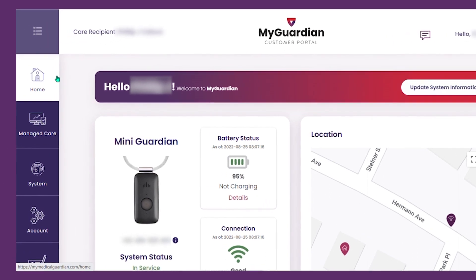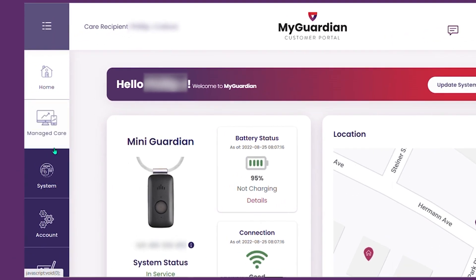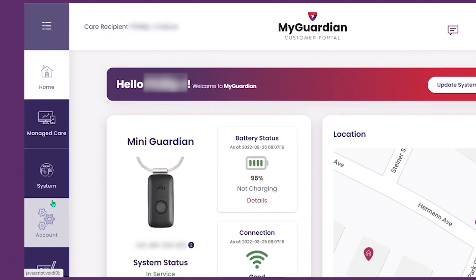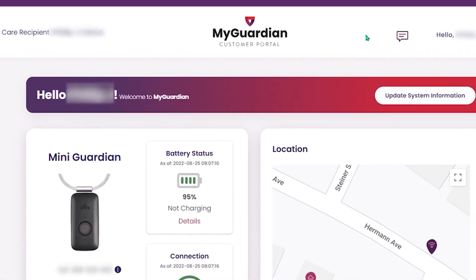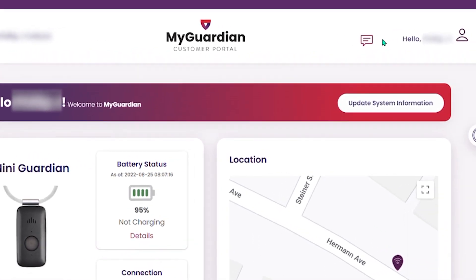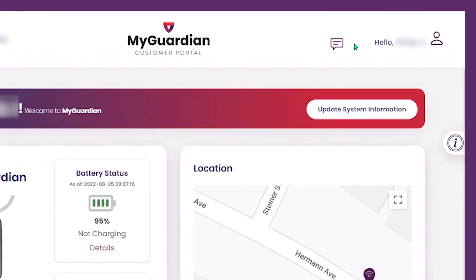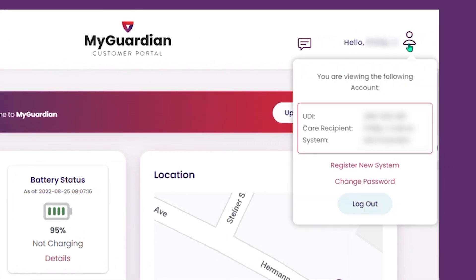On the left-hand side, you will see a navigation menu. At the top right-hand corner, click this to see chat history. Click this to register a new device, change your password, or log out.